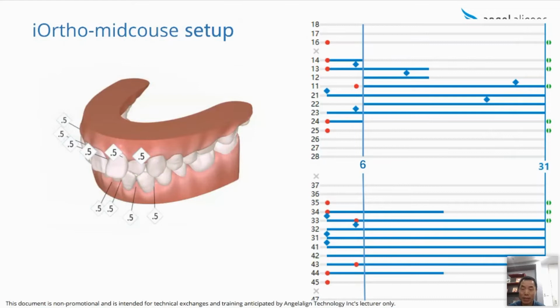In the whole process, there was no occlusal pad designed to open the bite. So the crossbite correction lasts a long time, and the occlusal interferences persist. That's why these two teeth were loosened. You can see from here, the crossbite was not corrected for a long time.